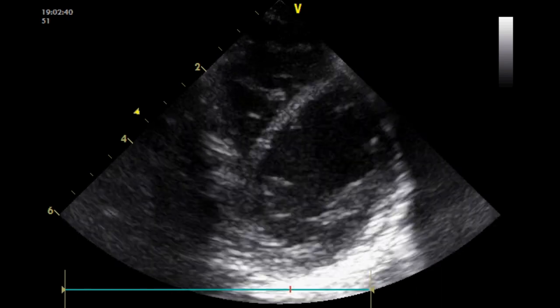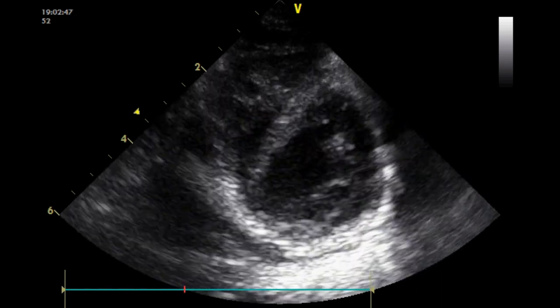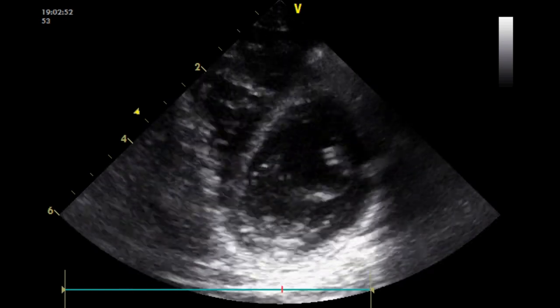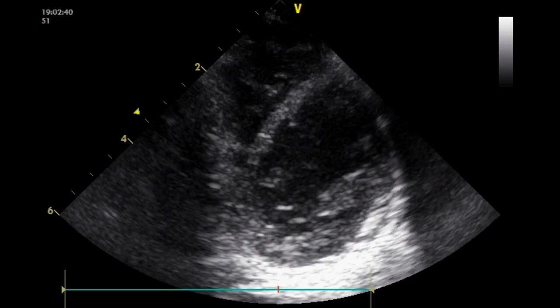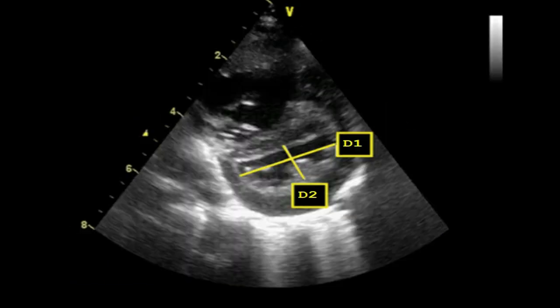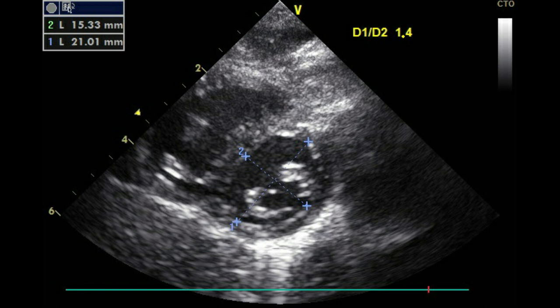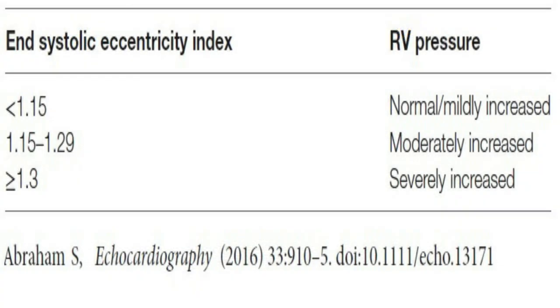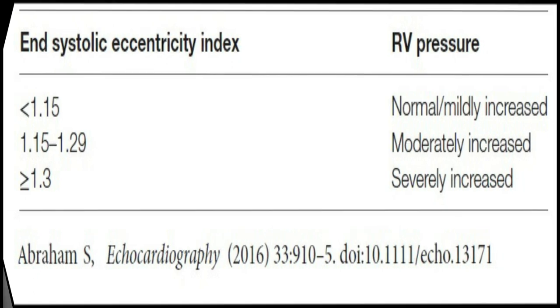A more objective estimation is made by calculating the left ventricle systolic eccentricity index, which is the ratio of left ventricle dimension parallel and perpendicular to the septum. The normal left ventricle systolic eccentricity ratio is typically 1. As it increases in pulmonary hypertension, it allows quantification of the more subjective parameter of intraventricular septum flattening and bowing. Serial measurements over time may allow monitoring of the progression of right ventricular pressure.